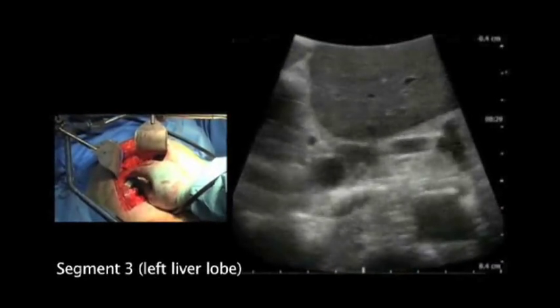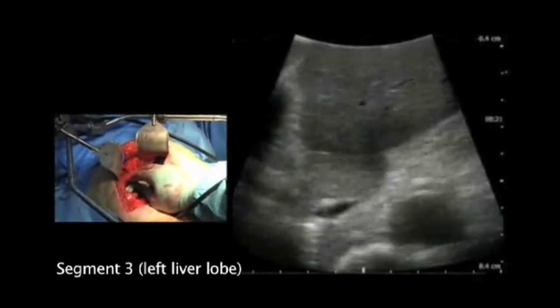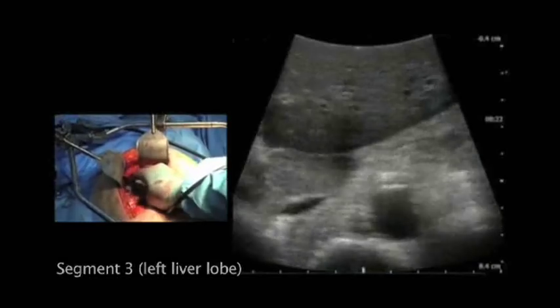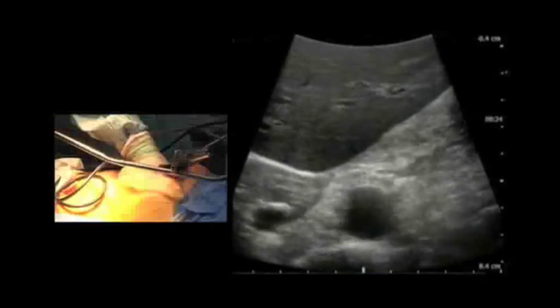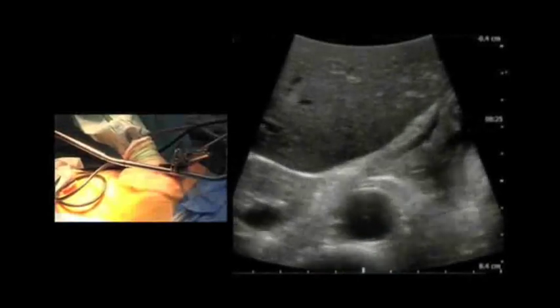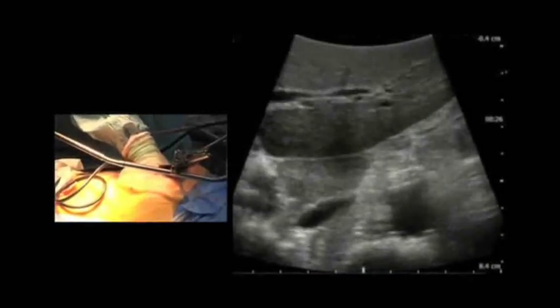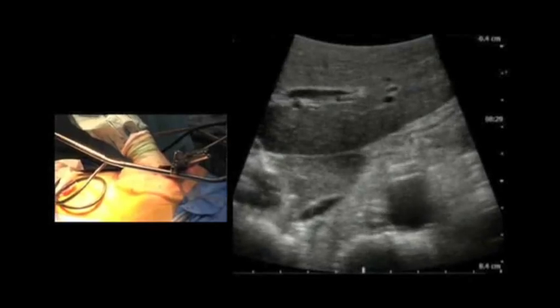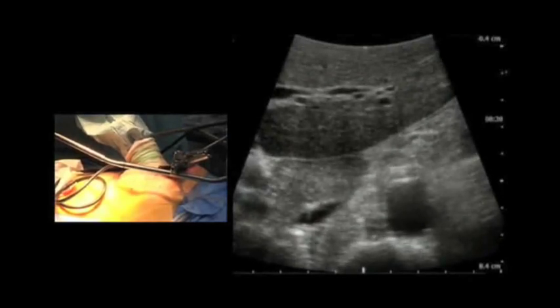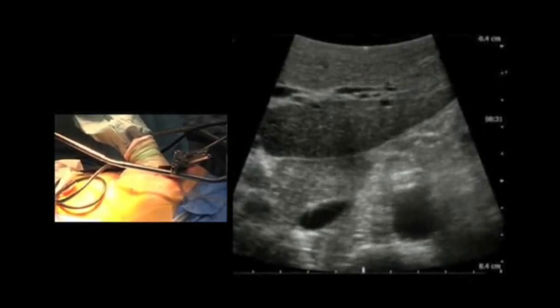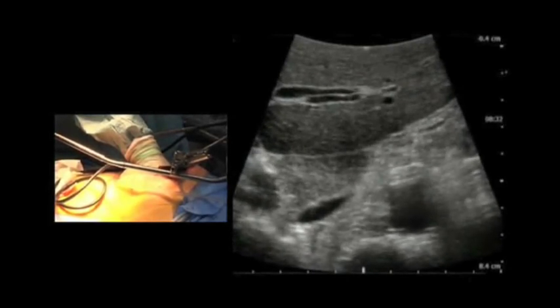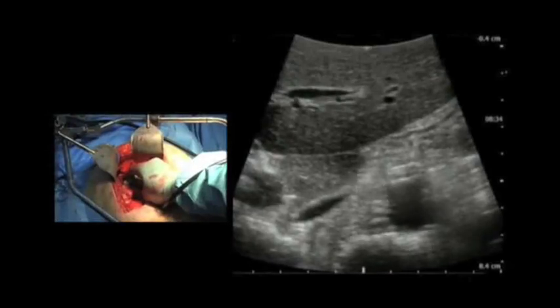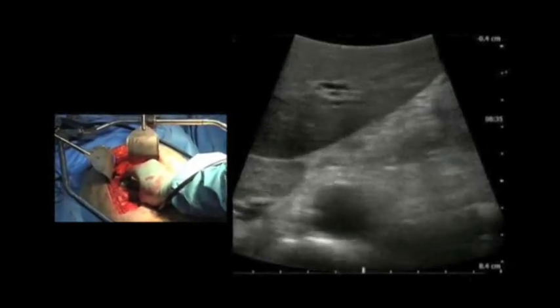Over here we have the left liver lobe, which we can scan and follow all the way out to the tip. You can see the central part separates segment two from segment three, and segment one is the lobus caudatus, which is placed underneath.